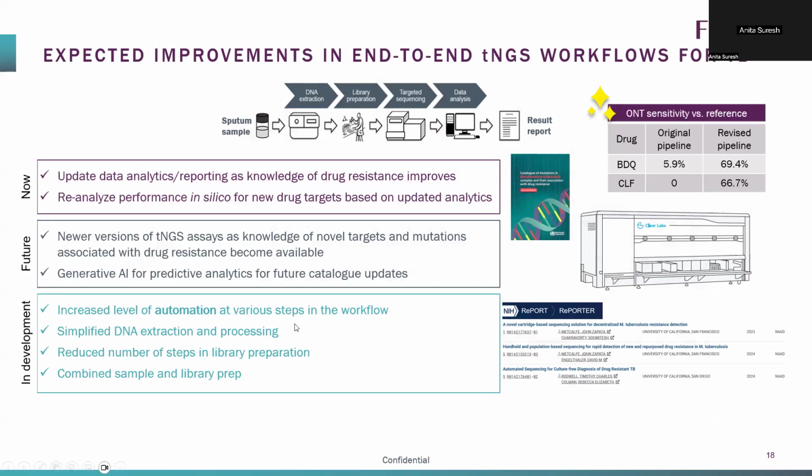There's more in there, but I think some of the other things you can imagine are automation, right? Obviously, I've taught you about 5 different things. It's extraction and the targeting, the PCR itself for amplification, the library prep, the sequencing, and then the reporting. But there is automation that's possible. There's people looking at combining the sample prep and library prep together, almost eliminating the need to do a separate amplification, doing all that in one tube and so on.